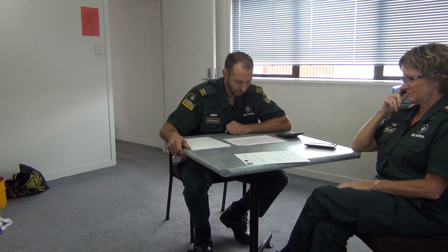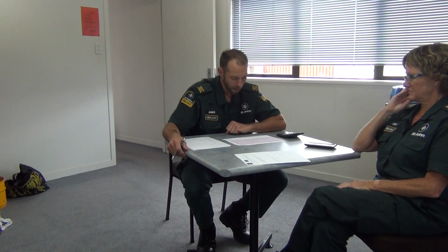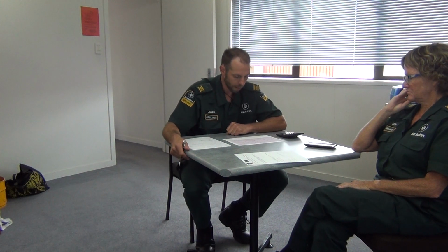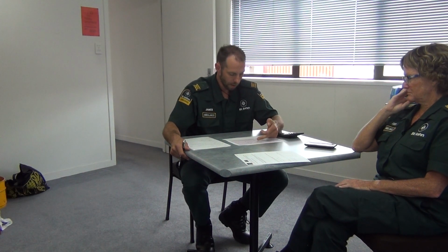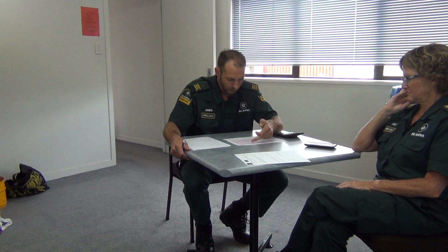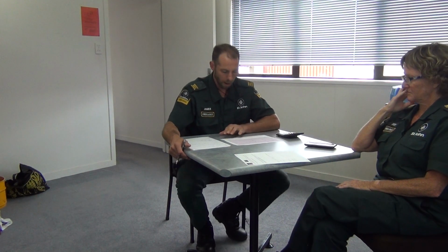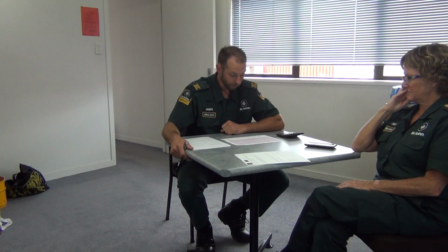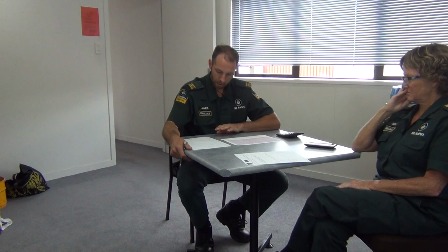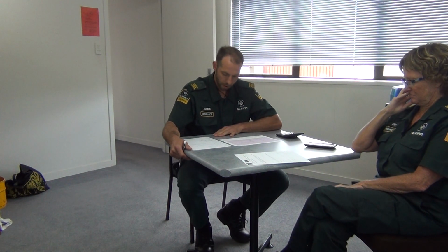The R wave progression in V3, it's not equiphasic, so therefore it looks like it's a slow progression. The ECG is good, it's nice and clean, hasn't got the paper speed, hasn't got the frequency response.